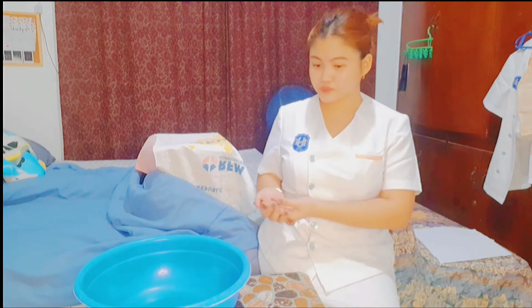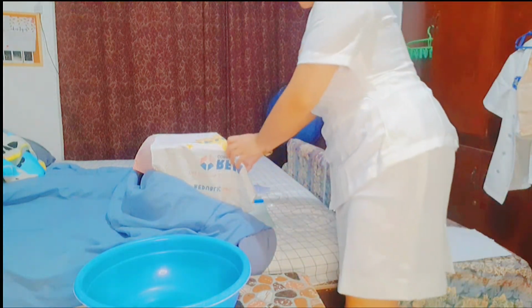Then, next, you need to check the institutional protocol or care plan. It is to ensure the proper procedure as well. And you need to place the client in supine position and expose the perineal area and the catheter.